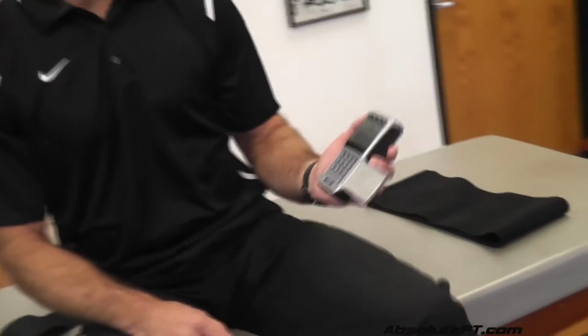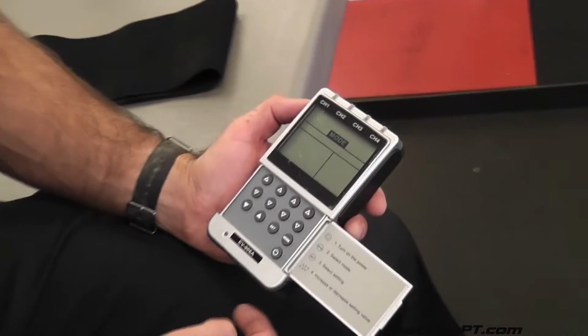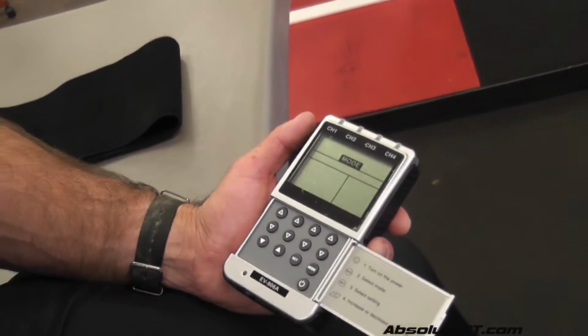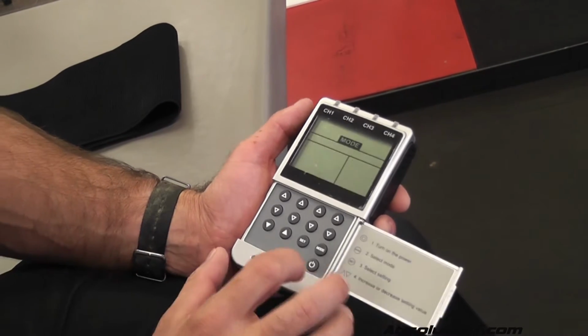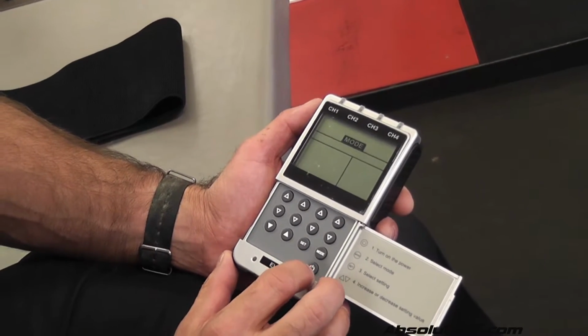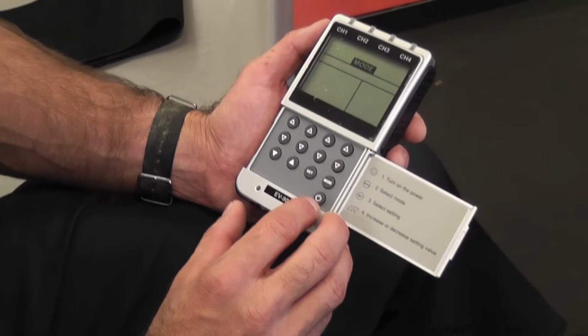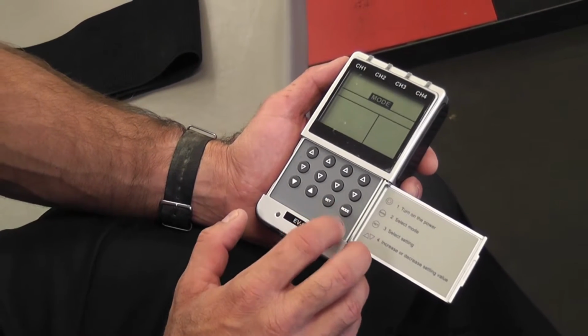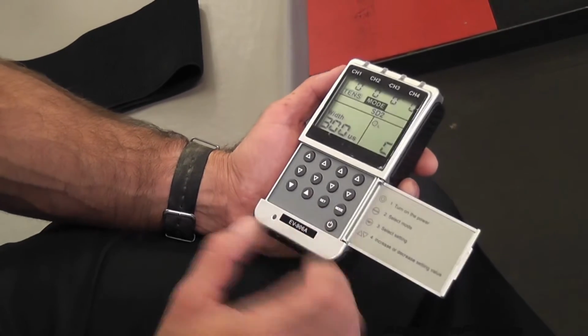But to program it, the way I program it for my go-to program, which is a 10-50-10 based on the Russian stimulation duty cycle, however not using the Russian stimulation waveform, but using an asymmetrical biphasic square wave, which is my second favorite wave.